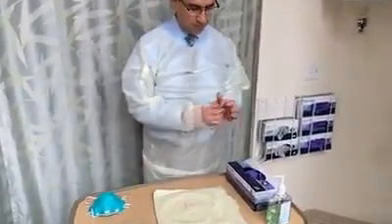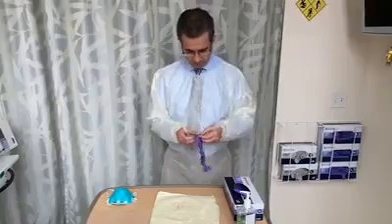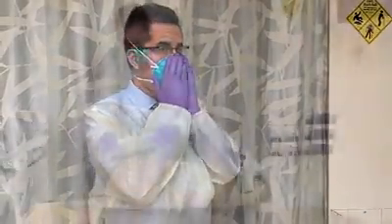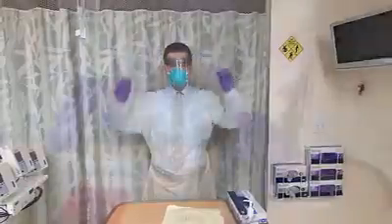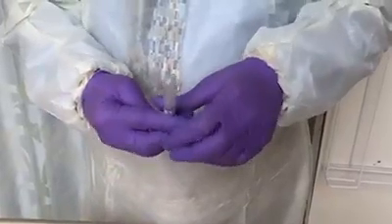First, put on a protective gown and wash your hands with soap and water, or use an alcohol-based solution. And put on a pair of non-sterile gloves, followed by a protective mask with a rating of N95 or higher, as recommended by the CDC. Finally, put on a face shield for eye protection. All sample tubes should be labeled and the appropriate requisition forms filled out before starting the procedure.